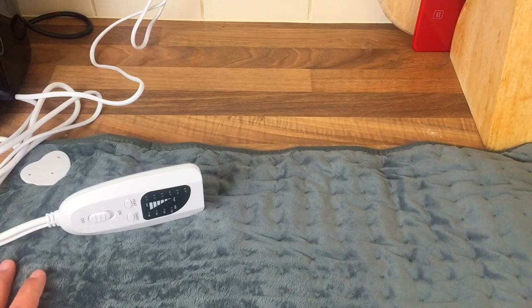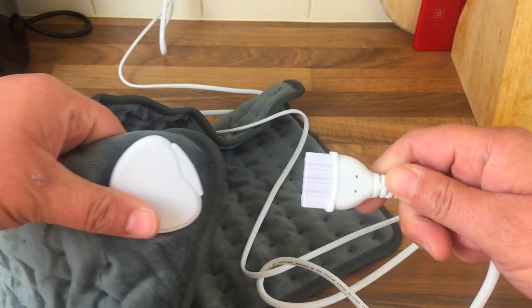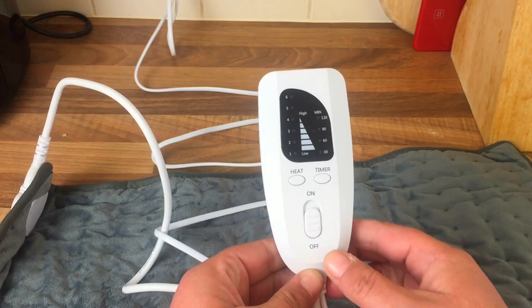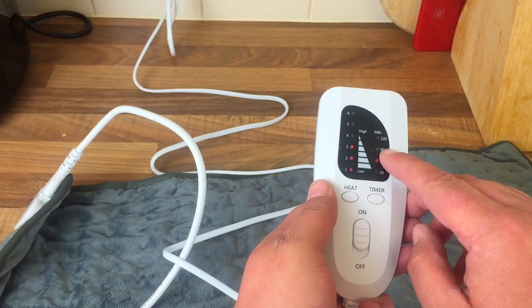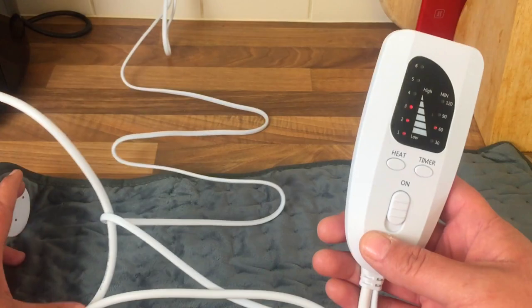We've plugged it in — here's the connection, it's a bit stiff, you just plug that in there and switch it on. You can see all the red buttons lighting up. It's got different settings: you can have it on for 30, 60, 90 or 120 minutes, and it goes up to level six. This was £15 off Amazon.